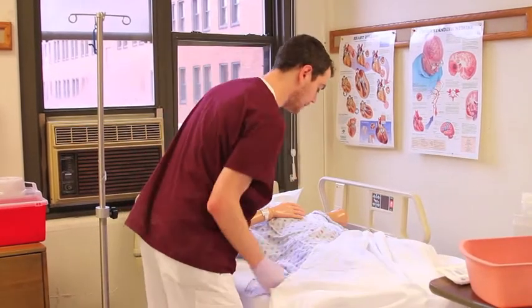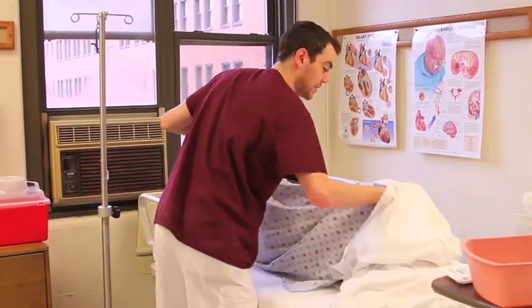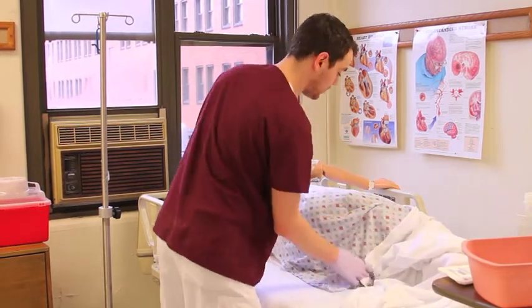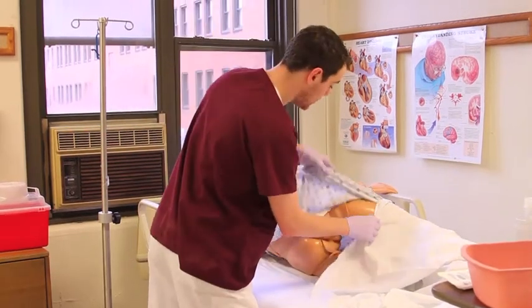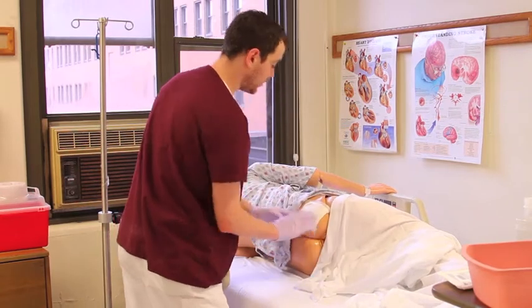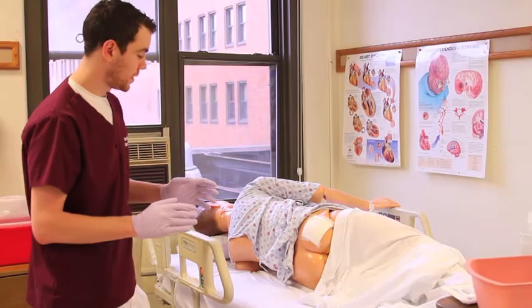So we're going to position him so that we can get to the dressing. I'll turn him on his side, and ask him to hold the side rail, position him over there. And again, you want to make sure you maintain patient privacy. So we'll do the best we can to cover that up and leave us enough room to do the dressing change. So the next step is to remove the dressing.